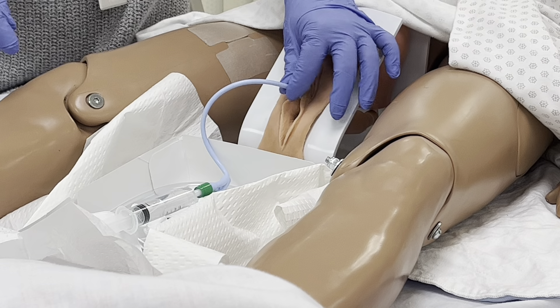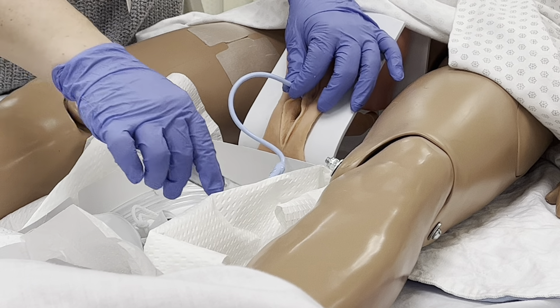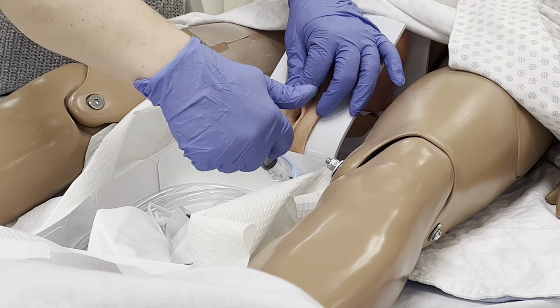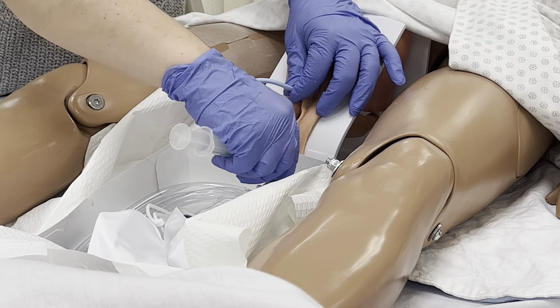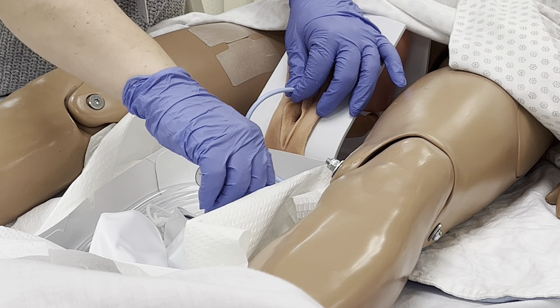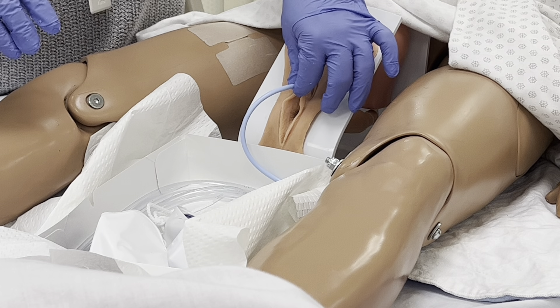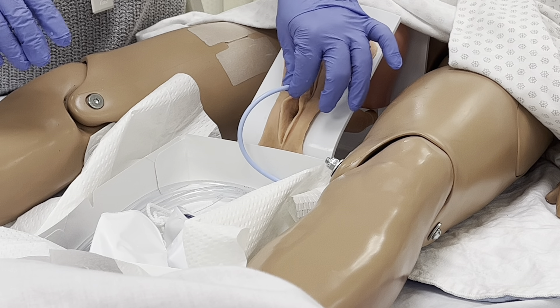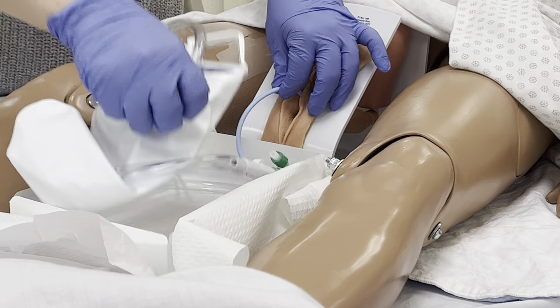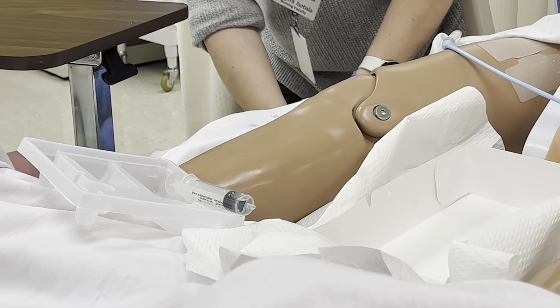I insert until I see urine in the tubing. When I see urine, I'm going to pinch the tube and grab the syringe. I'm going to insert 5 ml of water until my balloon is inflated. I'm going to pull back to make sure the balloon is inflated. I'm going to take the kit out, secure it to the leg, and make sure it's below the level of the bladder.